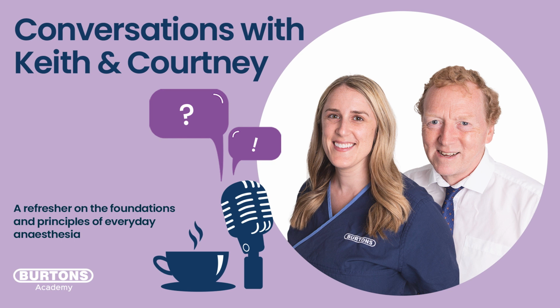And before you look at the tidal volume, you need to look at your end pressure, your peak inspiratory pressure. I'm assuming we're volume cycling here for the moment. So your volume cycling, you put in the volume, your end tidal is 46, you would increase the respiratory rate, and your pressure is 10 because that's where we started. But you're actually ventilating a 25 kilo dog. So it's quite reasonable that 10 could be 12.